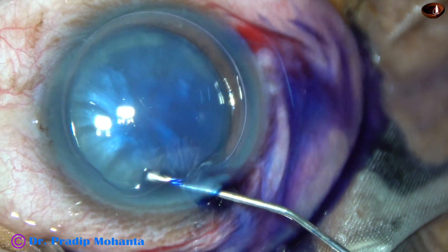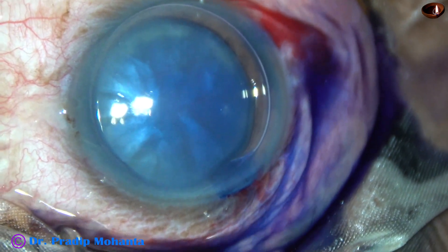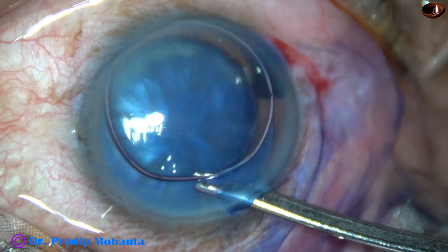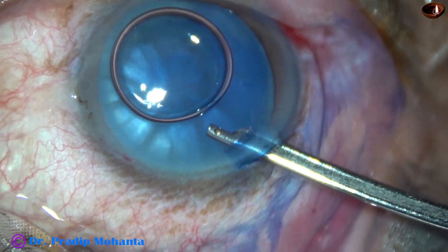So I went through the right side port. Now I am going through the main incision again and staining the upper part of the capsule. Uniform staining should occur. And then we can wash the dye out with BSS.